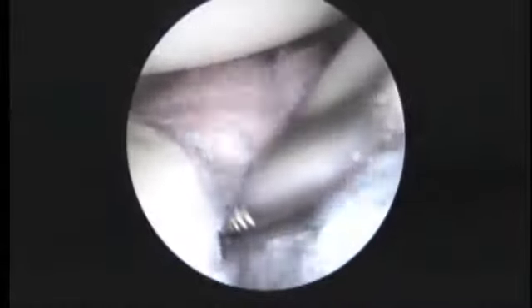We've freed up the anterior labrum and now we're going to see about repairing it. This is the edge of the bone on the front. There wasn't really any bone in the Bankart or in the labrum part of the injury, so there wasn't any bone to really repair — we're just trying to repair the labrum back to what's left of the glenoid here.